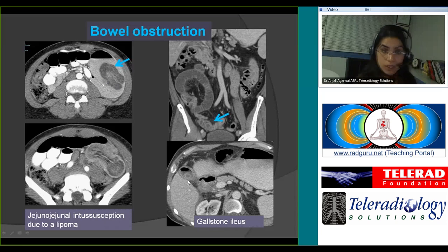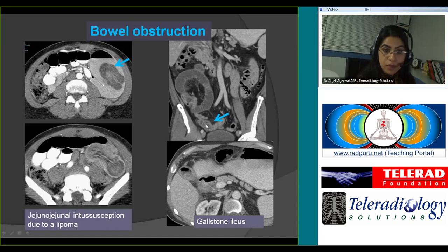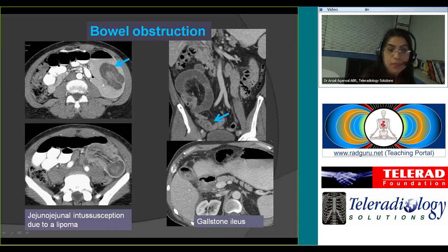In gallstone ileus, seen in elderly female patients aged 60 and above: look for air in the gallbladder lumen or biliary tract, presence of a cholecystoduodenal or cholecystogastric fistula, and look for the transition point. You can faintly see the stone in the small bowel — it's difficult to identify, but its morphology is similar to the stone in the gallbladder — and it is right at the transition point, with dilated bowel proximal and collapsed bowel distal to the impacted gallstone.